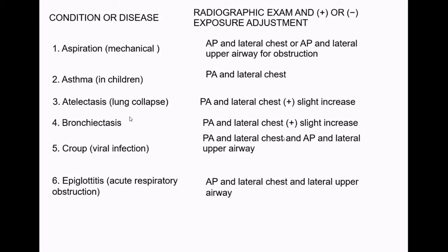For the croup, the same: the PA, lateral and the AP view for the upper airway. And for the epiglottitis, the AP lateral view. And the AP lateral view for the chest and the lateral view for the upper airway.